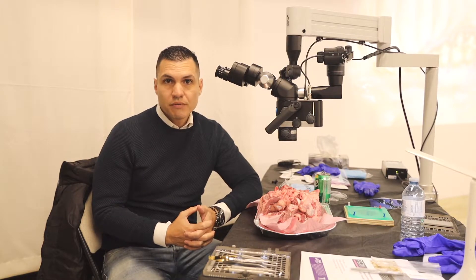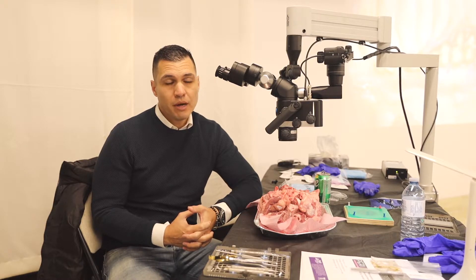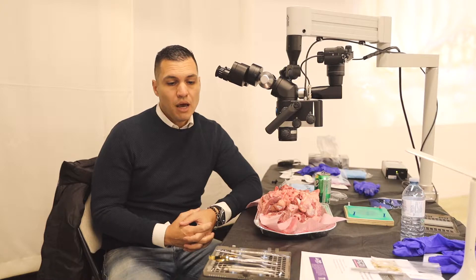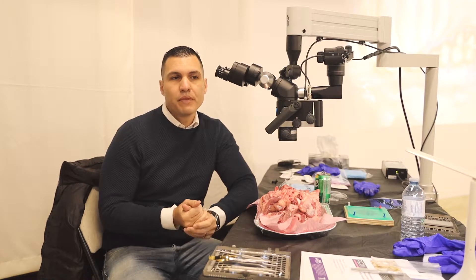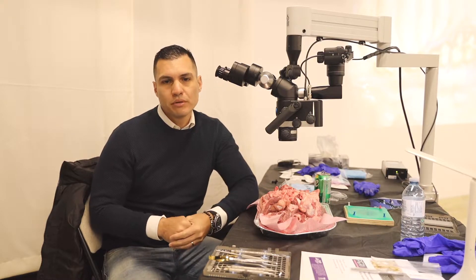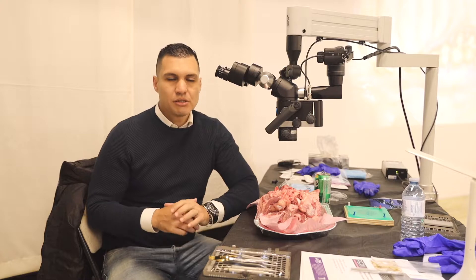I've been doing courses about this topic since, I think, three or four years from now, and I've been using this amazing microscope you see in Europe, in some courses in Europe, and it's extraordinary.